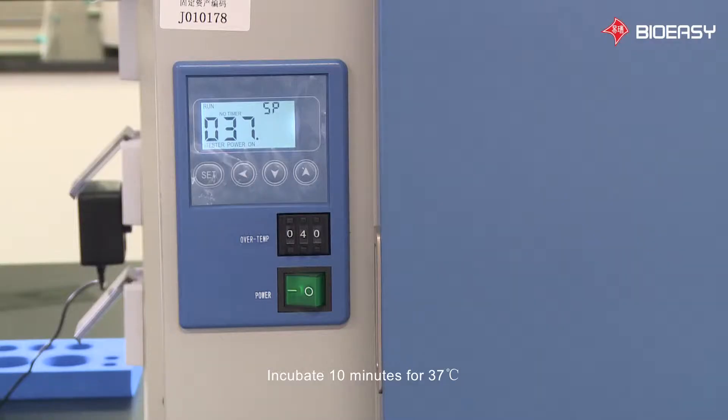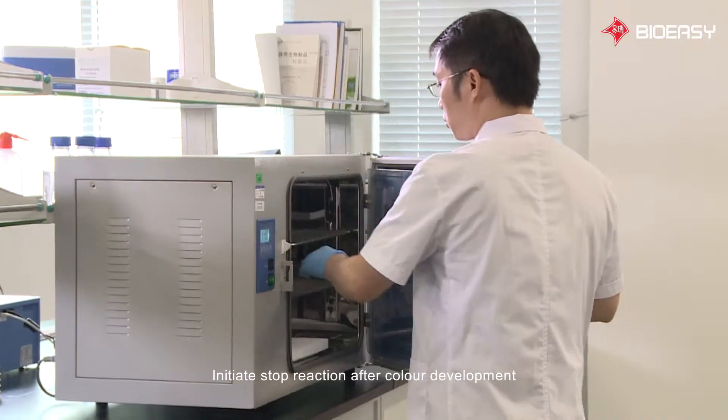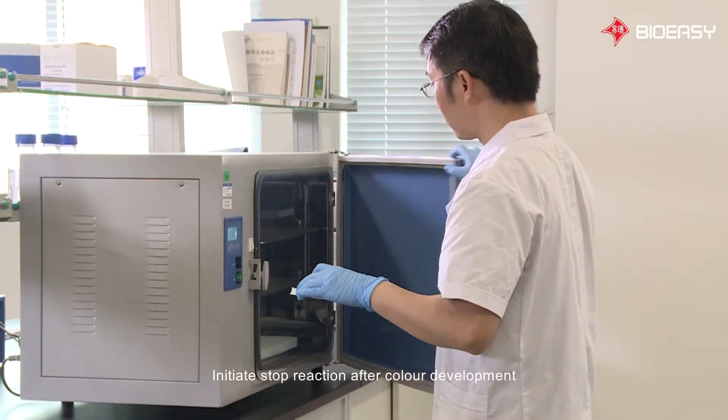Incubate for 10 minutes at 37 degrees Celsius. After color development, initiate the stop reaction.